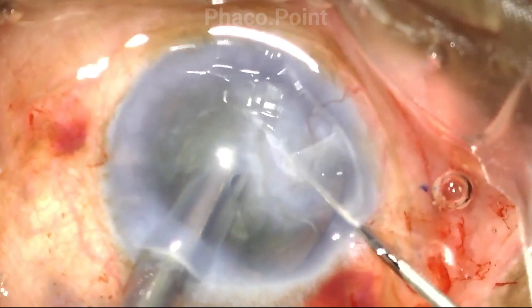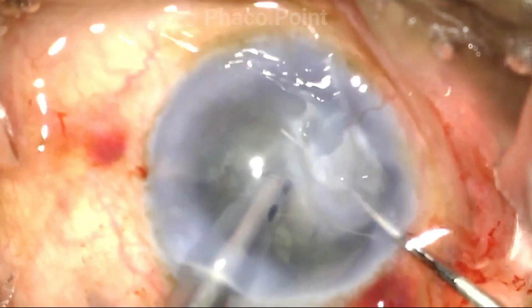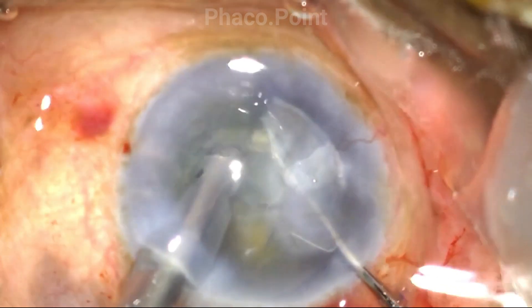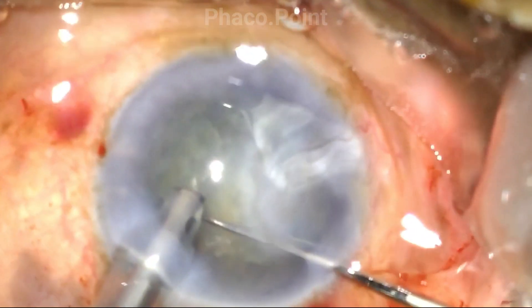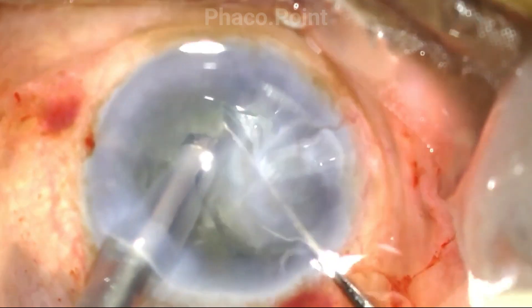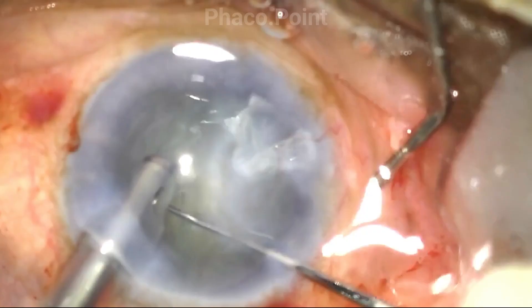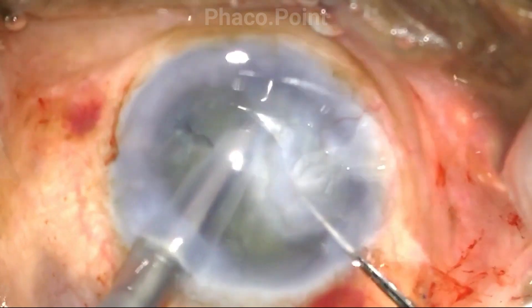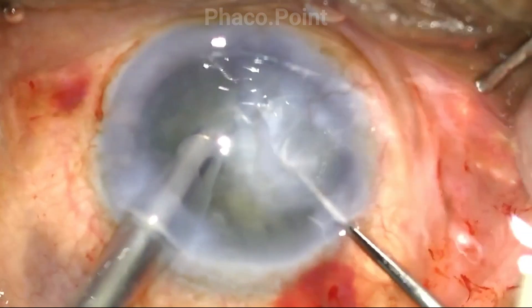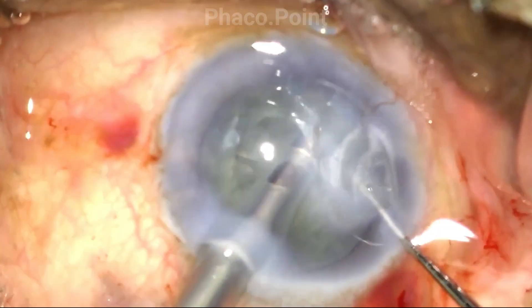This is a very important principle I follow: when it comes to nucleus management and irrigation aspiration, I try to perform as much as I can under direct visualization in the clearer part of the cornea. Sometimes it helps to merely rotate the eye to enhance visibility — pulling the eye with the second instrument towards the right can allow me to see a little more under the corneal opacity.